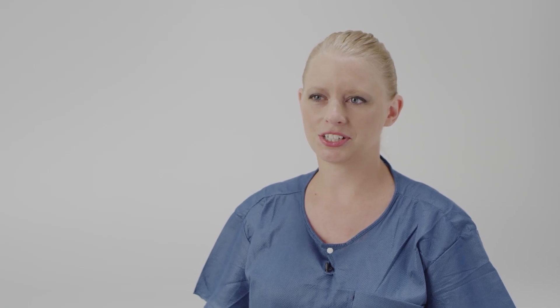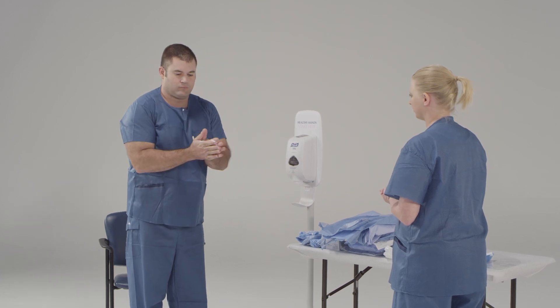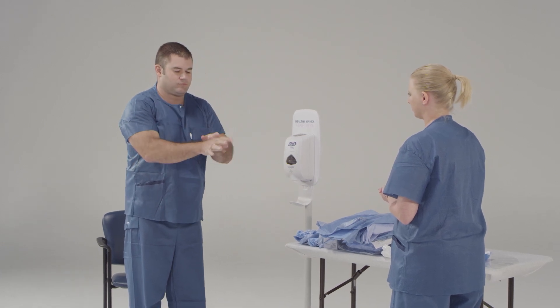First, before any procedure, we need to perform proper hand hygiene. Make sure that you get in between your fingers, the backs of your hands, and your wrists.